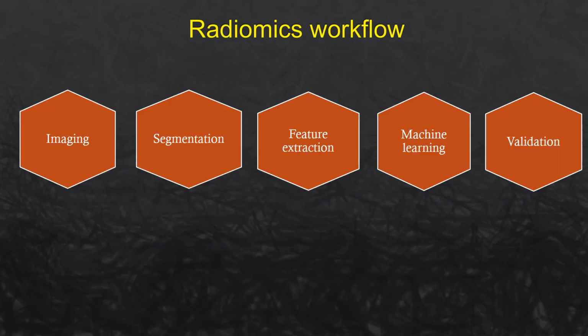A typical radiomics workflow includes starting from imaging, segmentation, feature extraction, machine learning, and validation. So you have to go through this whole process in every case, every tumor or every lesion that you take up for radiomics research.